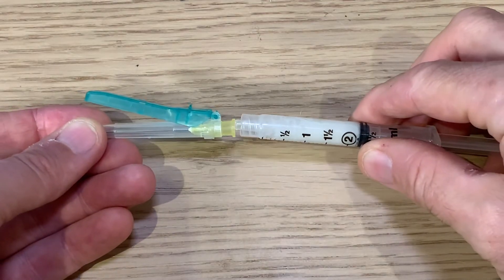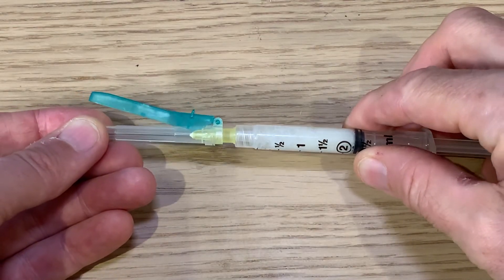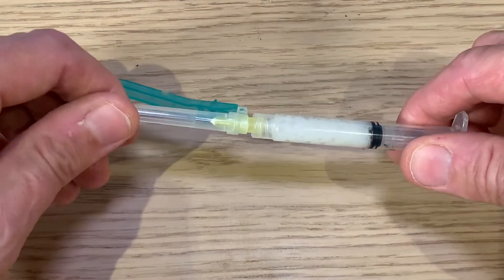The other needle is disposed of, and this new needle is the injection needle. The injection is given by deep intramuscular injection.